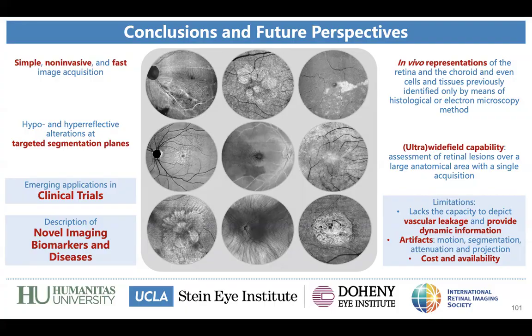For instance, the Cirrus from Zeiss that I use, they call ellipsoid zone or EZ, ISOS, a scan that they start in the RPE. They make the anterior and the posterior boundaries line from the RPE. So if you don't have the ellipsoid zone in the correct place, you will find something different.